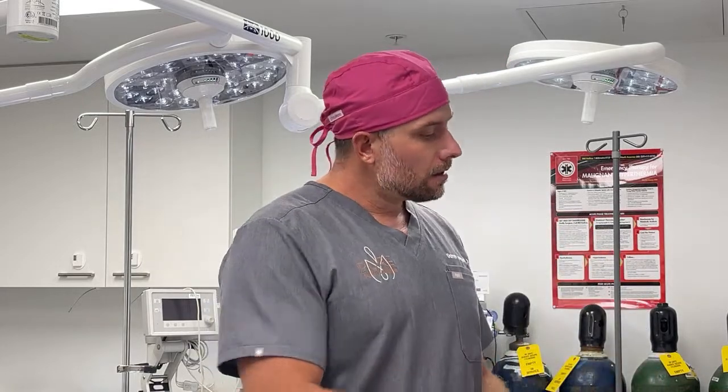So I only use, and everybody here at Pure only uses, smooth implants, meaning the texture is very smooth, and this has virtually not been described at all with breast implant associated ALCL. So that's why we choose those implants. With that being said, we can only use round implants, because if these round implants rotate or turn once they're placed, it's not going to make a funny shape. Those shaped implants with the textured sandpaper feel, they could put a teardrop shaped implant in, and that texturing actually kept it from rotating. So that's when they were able to do those shaped implants.